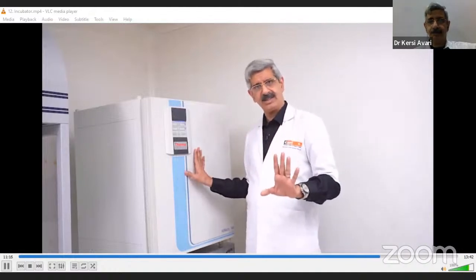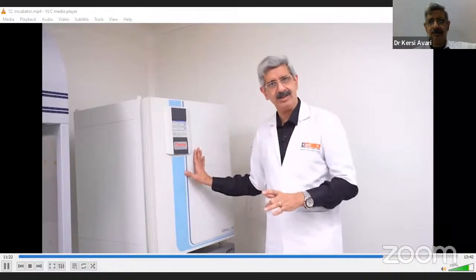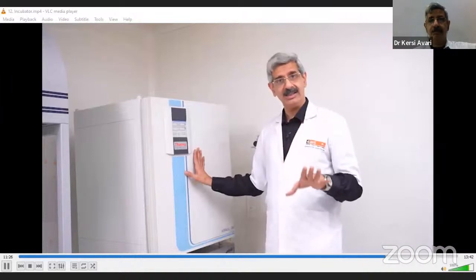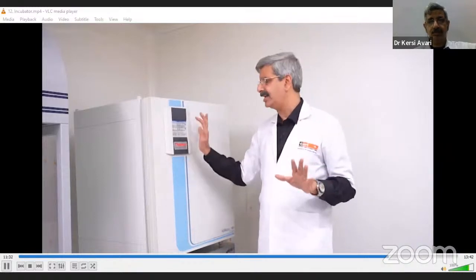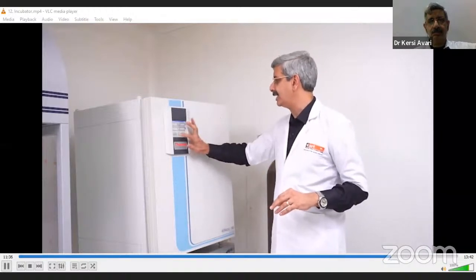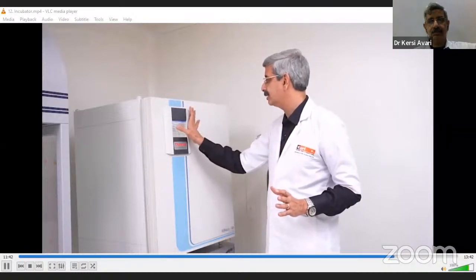When you clean them from inside, avoid spillage, gently handle the dishes, and library your dishes, who has kept where. It should be a one-man show. And last but not the least, please handle these toggle switches or your press-on switches very carefully, because they are delicate feather touches. As you can see, I can just press delicately the menu and it comes over here. Maybe options, whatever it is.